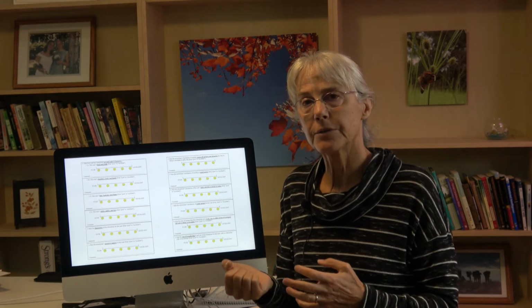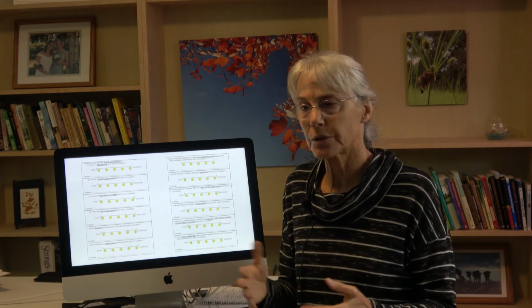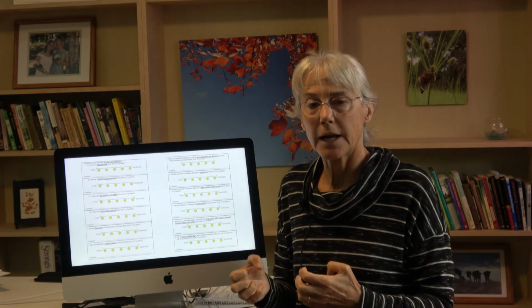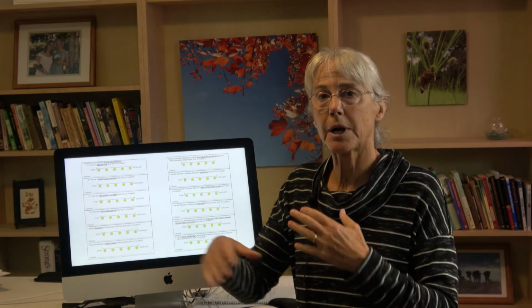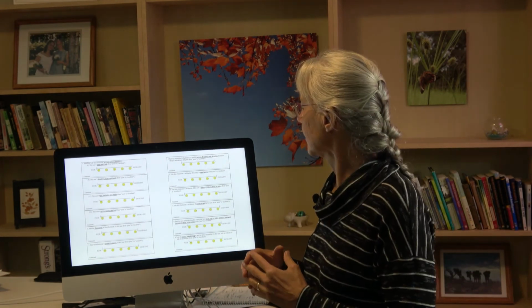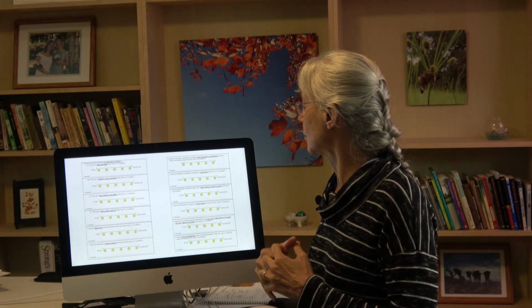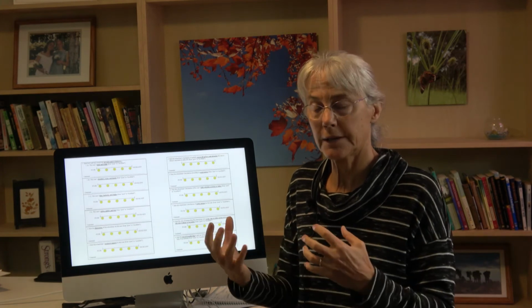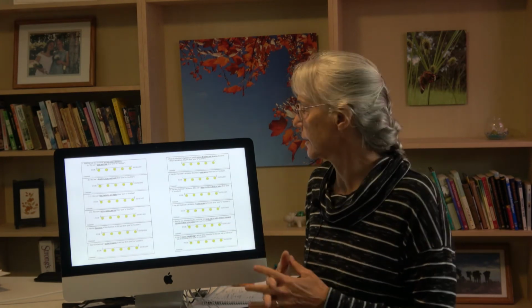This was pretty universal. Almost everyone will use some sort of desk or table. Even people that may be mentally challenged or have very limited upper body still can use a desk or table for some activities. Rate this wheelchair user's facilitation of social contact. Can they sit up and make eye contact? Is it moving them and giving them mobility in a way that lets them make the social contact?